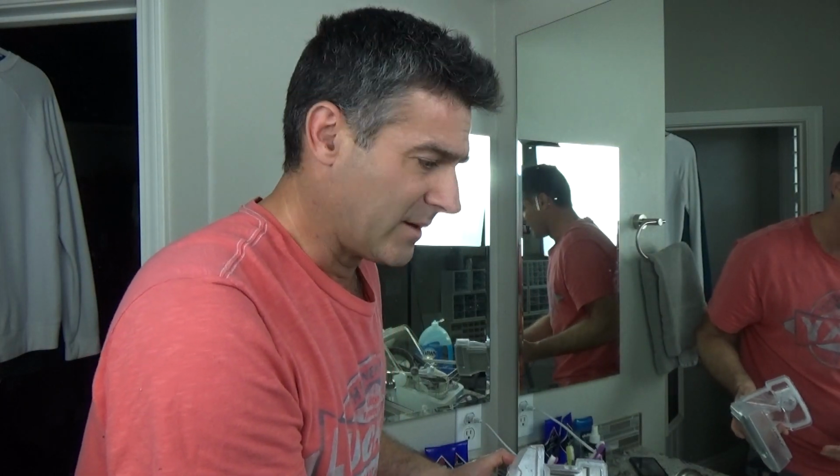Yes, I'm flexing on Mass Bright. But if you're using Dawn dish soap, Dawn dish soap doesn't really get it off as well as that. But it still works as far as cleaning it if your humidifier chamber is already clean.